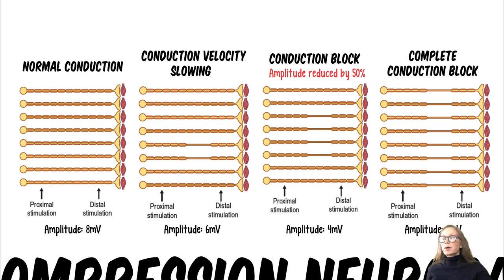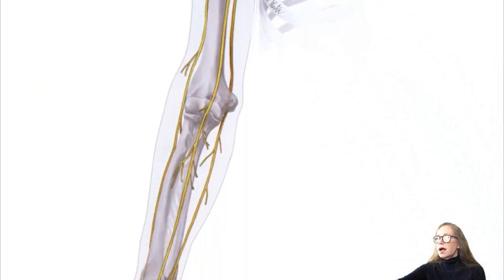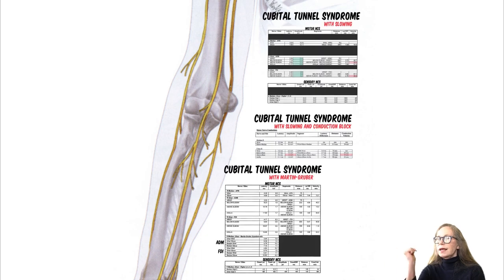We'll see diabetics with cubital tunnel, and you'll notice that they'll have slowing, say, in the forearm as well as at the elbow. But when it localizes to a known area, i.e. the forearm, the elbow, that's why they tell us look above and below, then that is really helpful to help localize. If there's slowing in the forearm, then it's going to be a systemic polyneuropathy or perhaps a Martin Gruber, and we'll talk about that in a bit too.